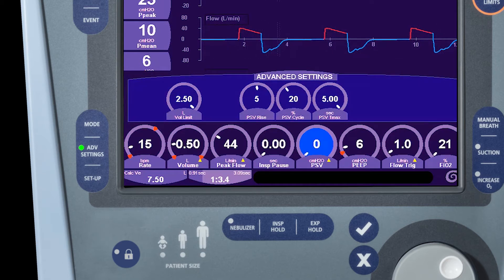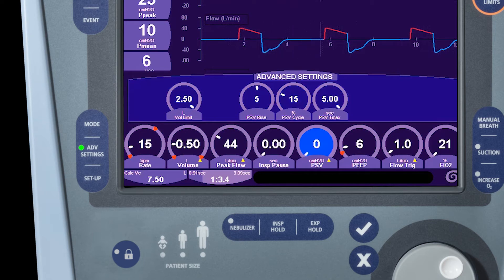To change an advanced setting is the same as changing a primary control: touch the control, turn it to the desired level, and touch it again to accept. Note that you can change advanced settings without changing the primary control.